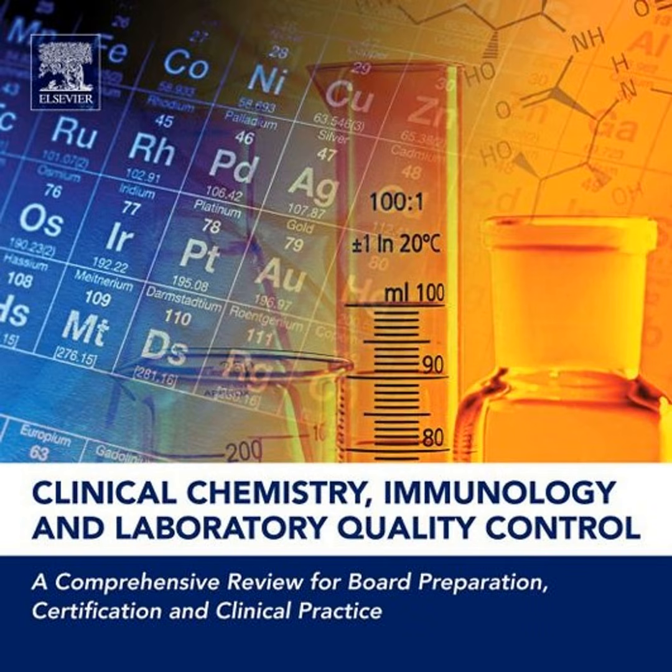Right. Why do we consider methods like GC-MS and LC-MS the gold standard? Well, because they offer superior specificity. Right. And they're robust. They physically separate compounds before identifying them chemically. Liquid chromatography tandem mass spectrometry, LC-MS, is often the single most sensitive method we have in a clinical lab. And that's essential for things like, what? Therapeutic drug monitoring and definitively confirming drugs of abuse. Places where you need to separate and identify a very specific molecular fingerprint.